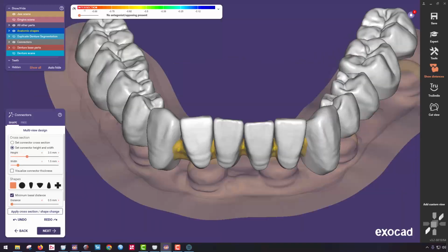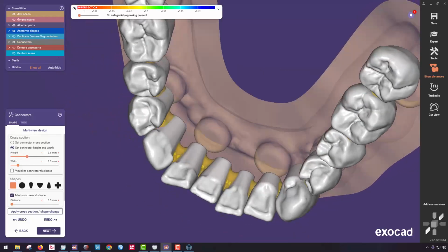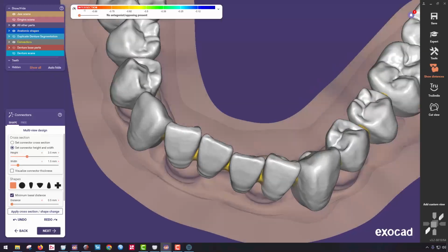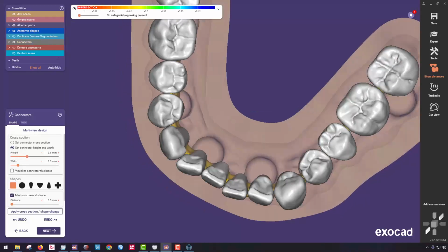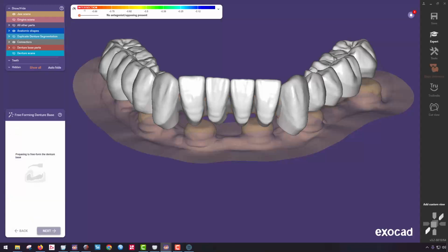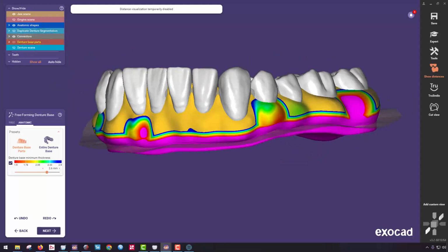Good. This one I don't like. Let me bring that a little bit more to the lingual. That's better. Good. Okay, and a little bit more lingual right here as well. Cool. All right, I'm going to hit the next button. That's now been applied. And now I can go ahead and double check that I have the correct base.